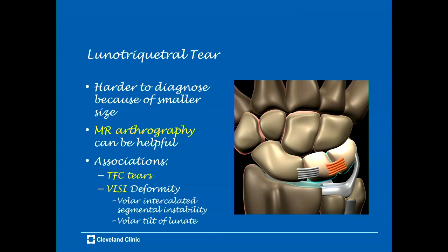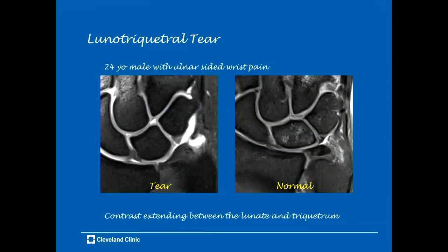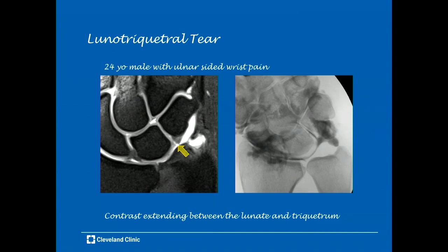Lunotriquetral tears are harder to diagnose than scapholunate tears, mainly due to the smaller size of the ligament, and MR arthrography can be especially helpful. These tears are often associated with TFC tears and can result in wrist instability — a VISI deformity, or volar intercalated segmental instability, where there is volar tilt of the lunate. Here's a 24-year-old male with ulnar-sided wrist pain showing a lunotriquetral tear on arthrogram, with contrast extending between the lunate and the triquetrum.